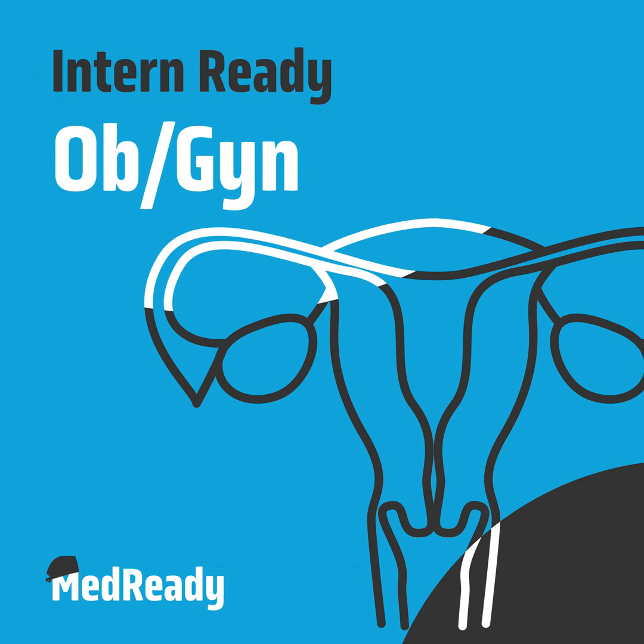The other parts include the light source. When you're putting it together, you'll hear this plenty of times in the OR: make sure to keep the light source away from the drapes and away from the patient's body as best as you can, because it is very, very hot. And then the camera system, which is where you're actually able to see the images on a video monitor. And then usually for an operative scope, you'll have a working channel where you can place things like graspers and scissors, when you want to go from a diagnostic hysteroscope to an operative one. That's kind of big picture.